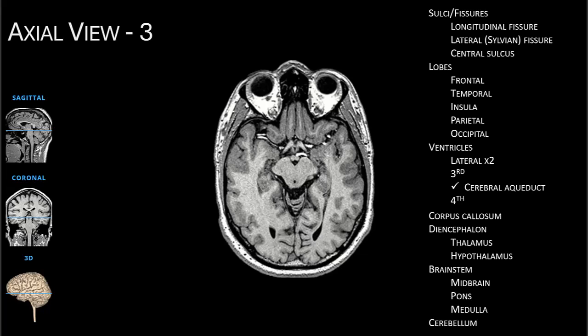Now we've reached the level where we begin the brain stem, specifically the midbrain, which looks a bit like a Mickey Mouse icon. The black dot in this region is the cerebral aqueduct bringing fluid from the third ventricle to the fourth ventricle below. Of note, there are two little circles on the anterior surface of the midbrain — these are the mammillary bodies. We see the inferior portion of the frontal lobe, the main portion of the temporal lobe, as well as the occipital lobe. This yellow portion is a lower portion of the hypothalamus.